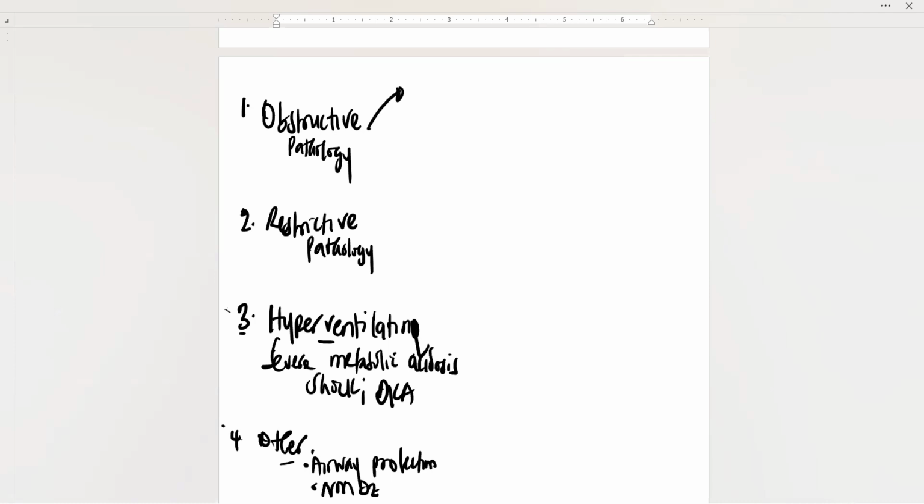So with the obstructive pathology, like we said yesterday, when we're initiating mechanical ventilation, we divide the settings into two: oxygenation and ventilation. So we have to set what goes up on the ventilator for oxygenation and what goes up for ventilation. In terms of oxygenation, like we said yesterday, we're going to set our FiO2, and it could be anywhere from 21%, which is usually the least, to 100%.